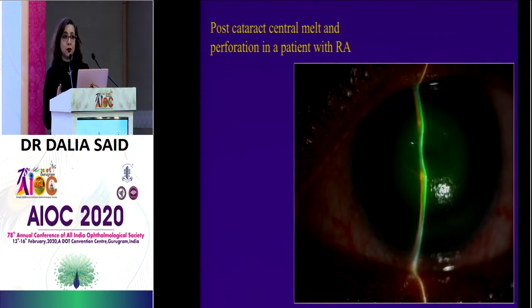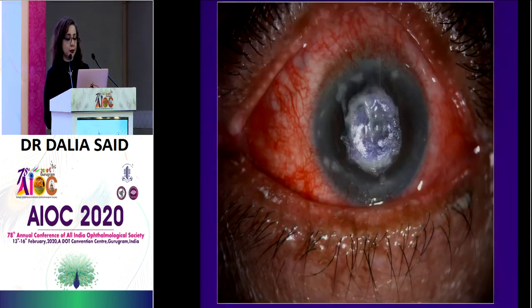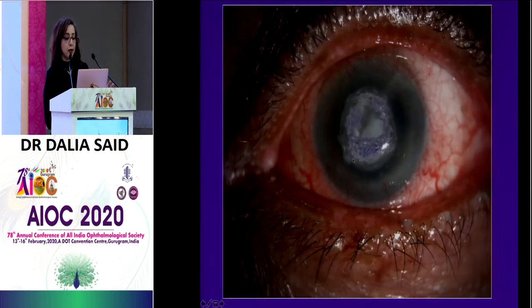So remember, with rheumatoid arthritis, sometimes the eye is very dry and you can get a corneal leak from the non-steroidal anti-inflammatory. And this is the one where one of the residents has glued that patient, and you can see how much excessive glue is there and that she's not removed the fibrin or any of the discharge. So the patient had a lot of inflammatory action. Can you see these inflammatory spots after? And we had to treat very aggressively with antibiotics and steroids. And that part remained not clearing at all.